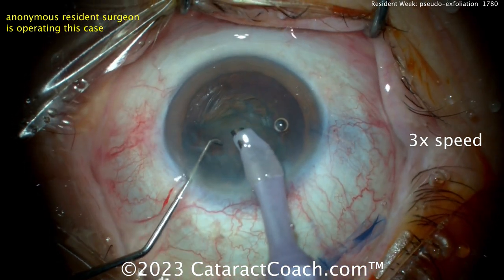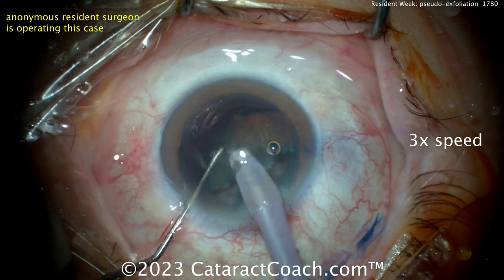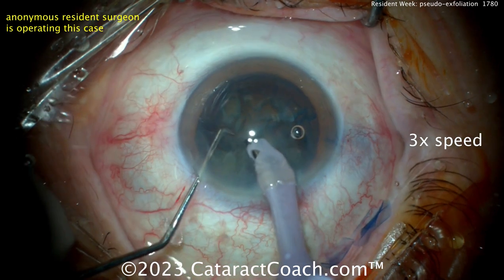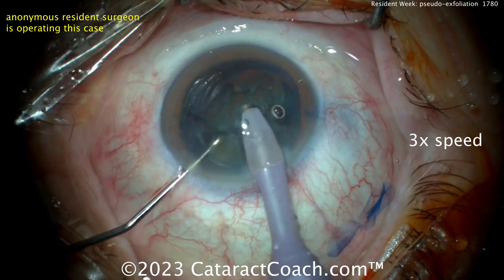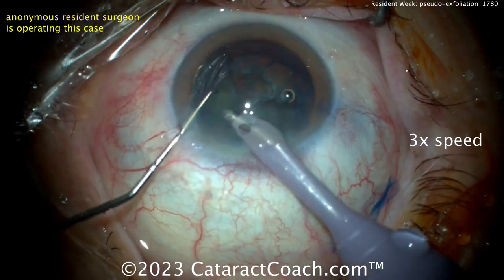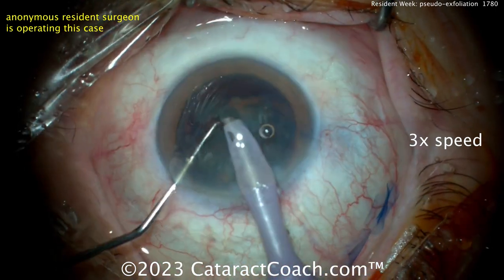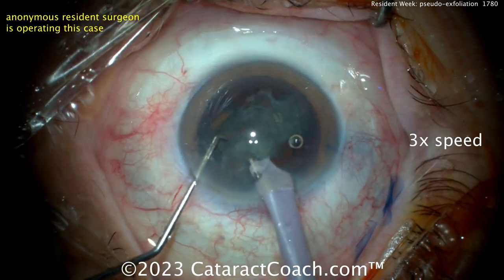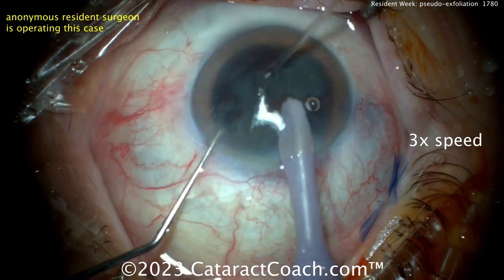Remember: the center of the nucleus is denser. The peripheral nucleus out toward the equator is a lot less dense in almost every case of nuclear sclerosis. As a result, you have to be very cautious when putting the probe toward the equator — you don't want to apply a lot of phaco energy there. Now let's see another chop. You want to keep the phaco tip in a good position so that the nuclear pieces are in front of the phaco tip and easily accessed.